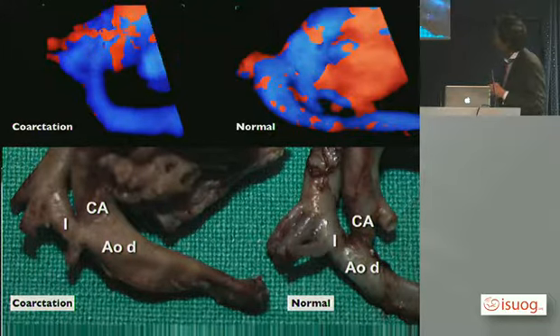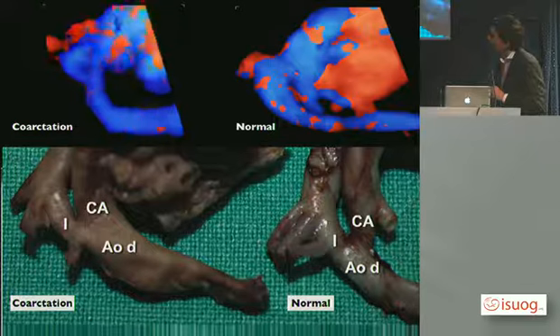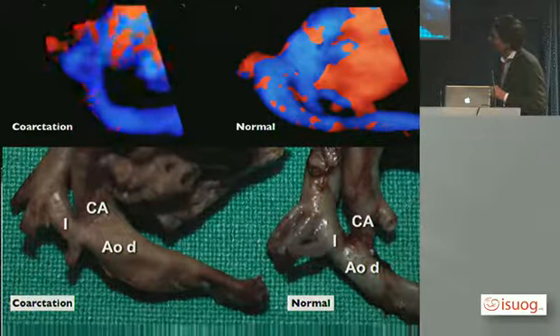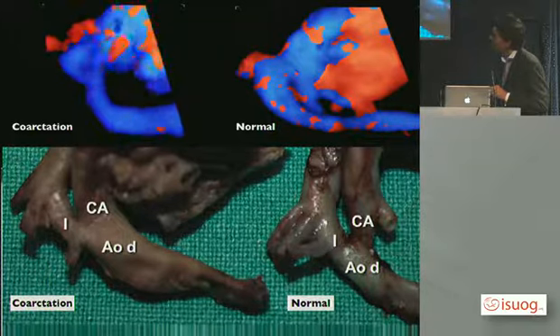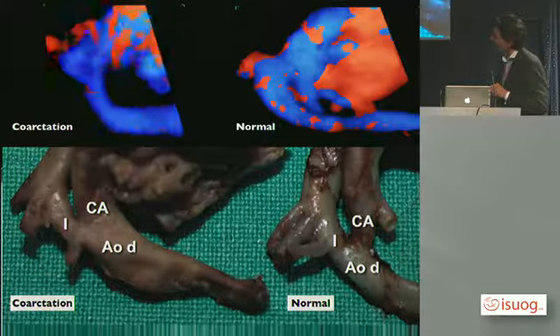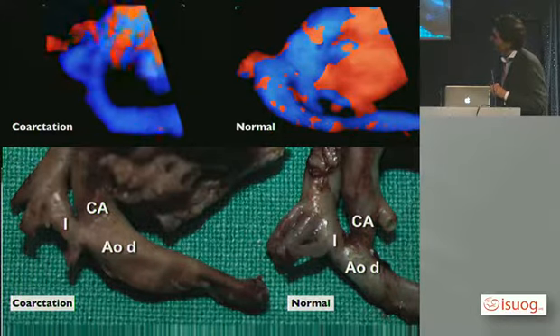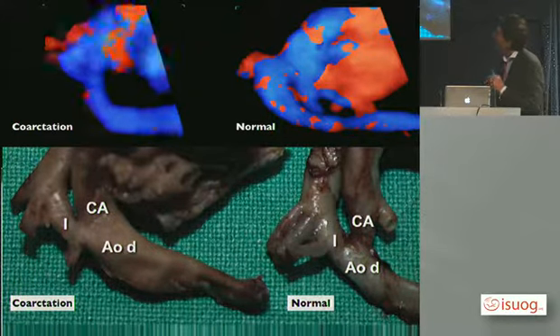But when you suspect coarctation of the aorta in utero, some babies will have this kind of fashion that Jolene described very well some years ago, which we call postnatally a shelf indentation. You can see that in coarctation the descending aorta comes just after the ductus arteriosus, and here it's like a step. You can see the correspondence.